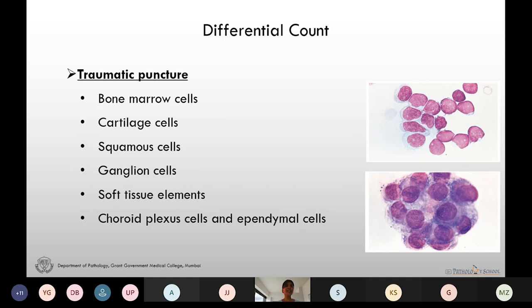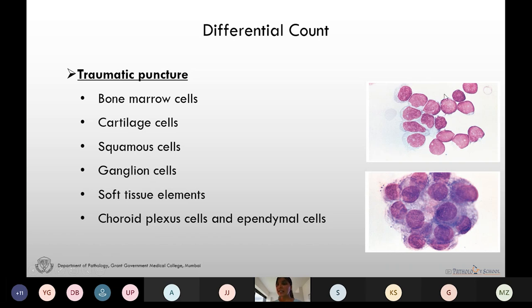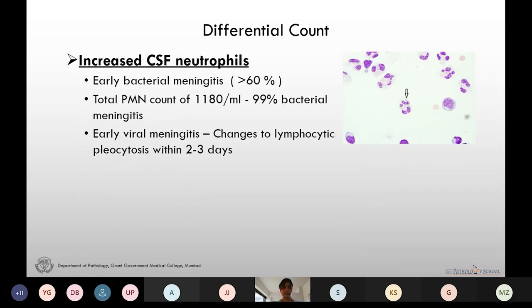Various types of cells can be seen in the CSF in traumatic puncture. In this picture we see choroid plexus cells, which are large cells with abundant cytoplasm, large round to oval nucleus, and dispersed chromatin. These are blast cells which come from the bone marrow of premature infants. Now let's see one by one the increase in specific types of inflammatory cells.